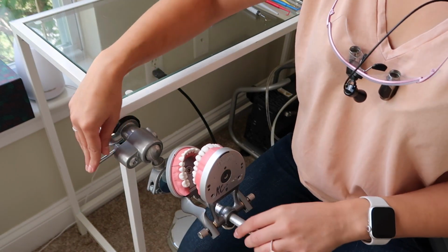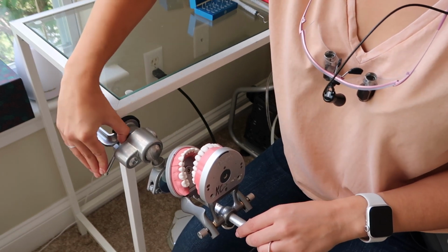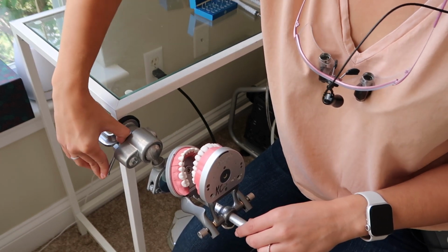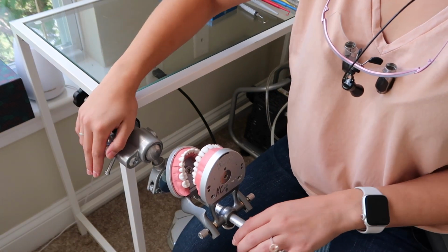I don't need that much practice. I don't need it to be that realistic. I just need it to be mounted. So this does a great job. You can adjust it by this knob over here. It tightens it and it does not move anymore.